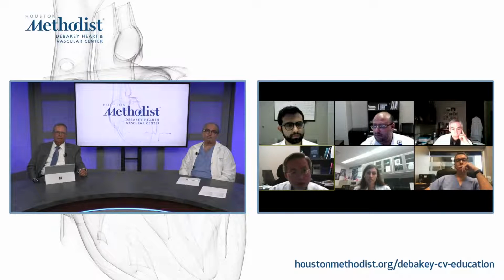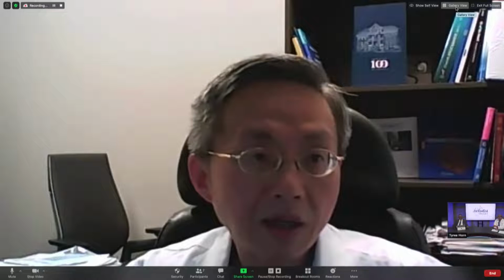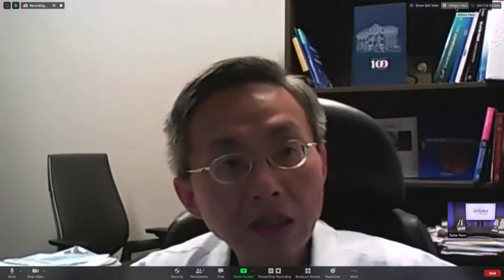I think both, because the location was distal left main with a large, non-calcific plaque, and he was still having non-specific, not atypical symptoms. As you could see, he's a very anxious guy. He couldn't even lay still in the PET camera. Despite that, the CT-FFR for the LAD and distal left main did not show significant disease. CT-FFR has its pitfalls, and I think Dr. Mahmarian will show a very nice case of that.